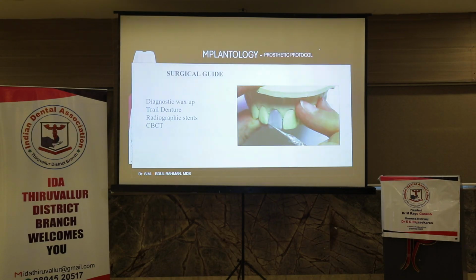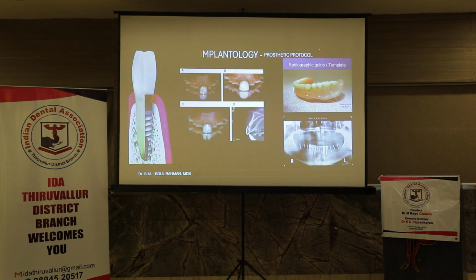Surgical guide, of course, if the patient is not affordable, if we can't make a surgical guide, there are some things we have to use for a surgical guide. One is diagnostic wax up, trial denture. Diagnostic wax up, I already showed that box wax up. அதுவே நம்ம place பண்ணிட்டு சென்டர்ல இனிஷியல் drill போட்டு angulationக்காக. So future outcome tooth நமக்கு முதல்ல தெரிஞ்சிரும். அதோட மிடில் இருந்து போகும்போது angulationஐ அவாய்ட் பண்ணிக்கலாம், irregular angulation.